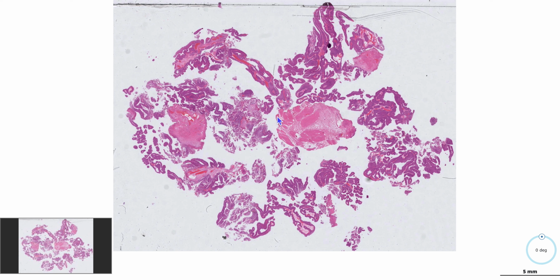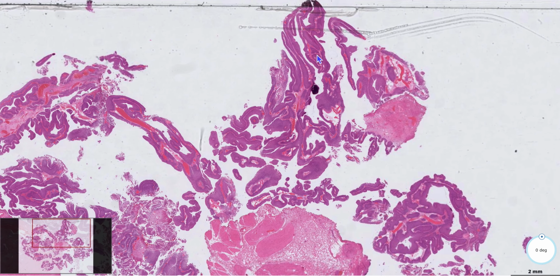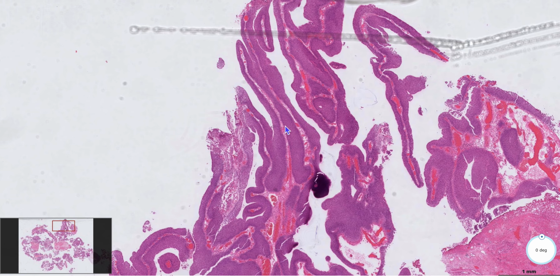No prior history of urothelial carcinoma though. And they did another transurethral resection of bladder tumor. Now these are all fragmented, but I can see from low power that they're exophytic, meaning they're growing outwards. And as we zoom here, we can see these fibrovascular cores, so they're papillary.